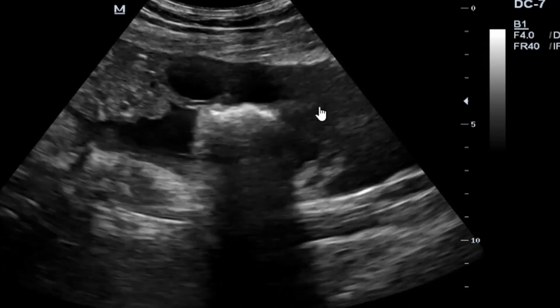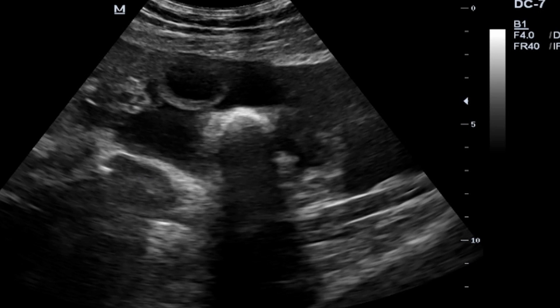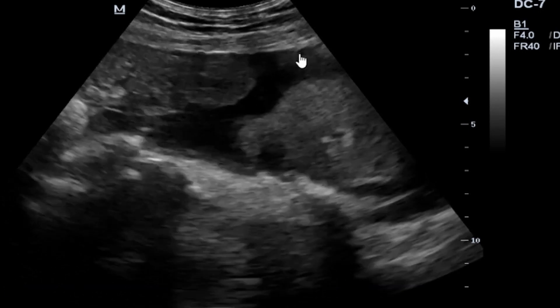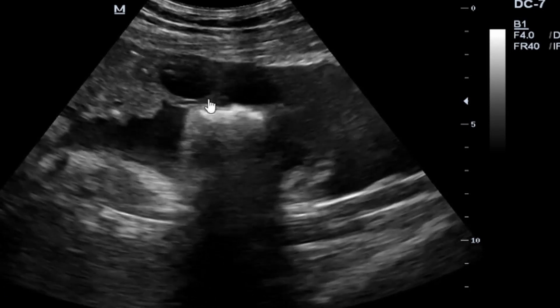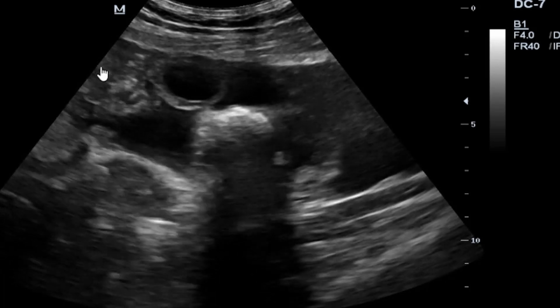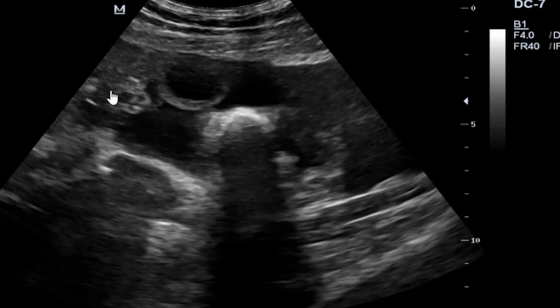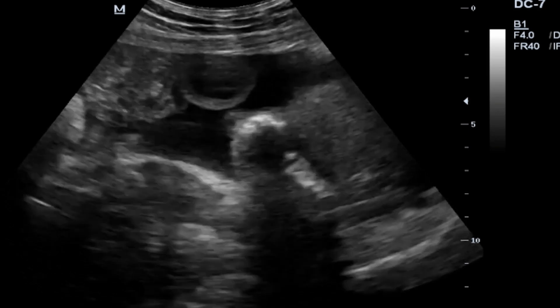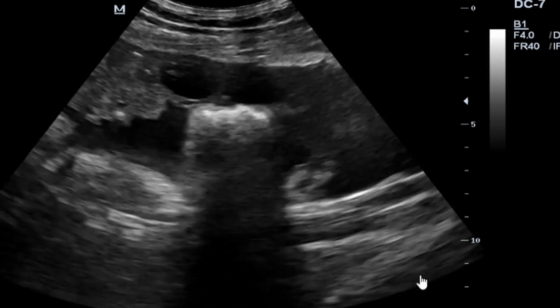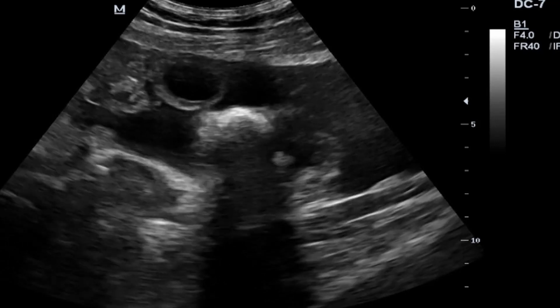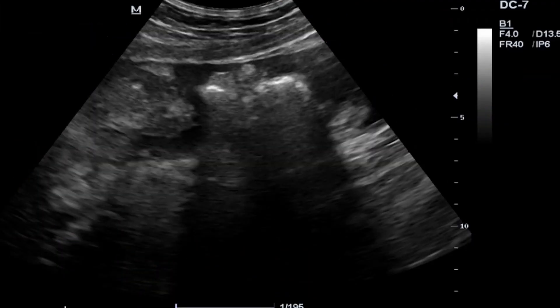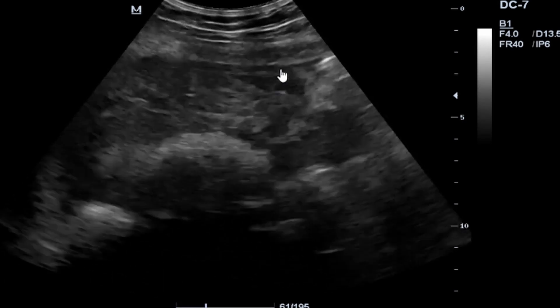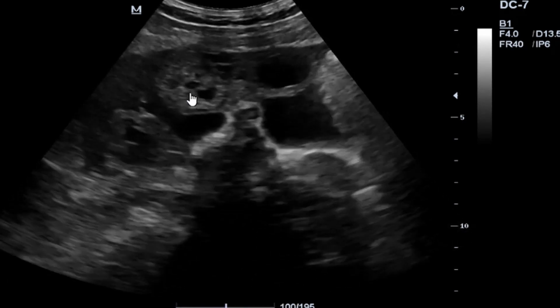Here you can nicely see our uterus coming here, and then there's free fluid around it. Then there is a lot of fluid, and this is part of the retained dead fetus — or demised fetus — as you see there.